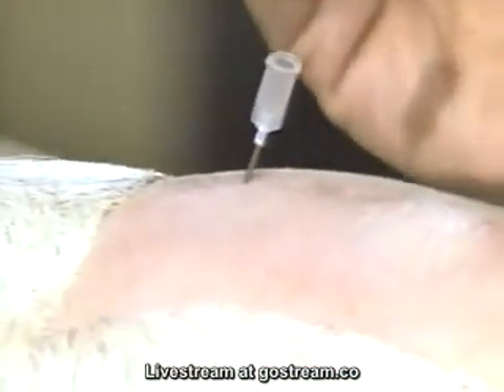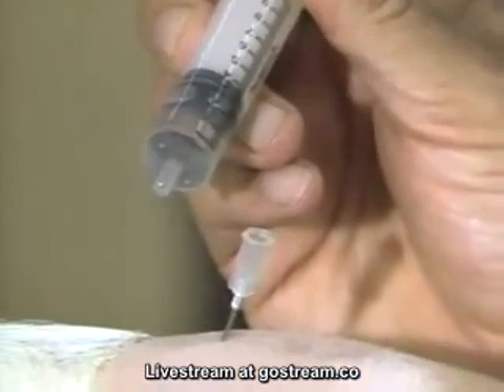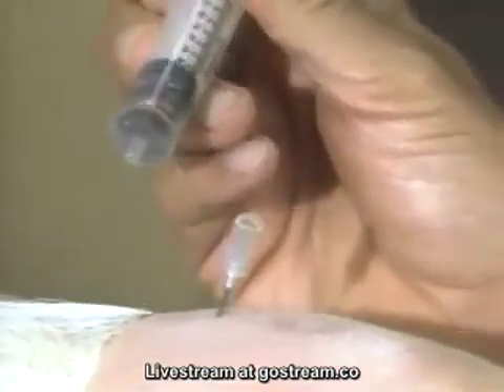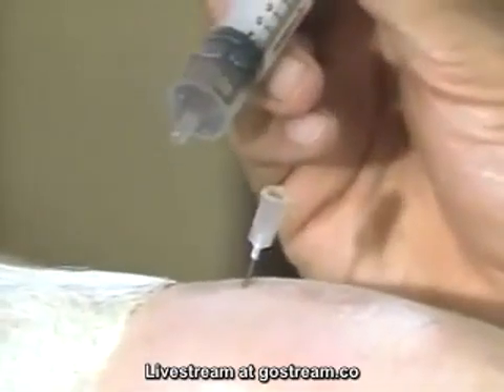As for the anesthetic, I'm using lidocaine, and I'm measuring the dose to be approximately one-half cc per hundred pounds of body weight. So if this heifer weighs about 600 pounds, we're going to give about three cc's. That will be just enough to get anesthesia to the perineum.